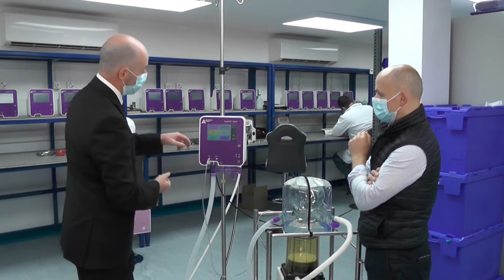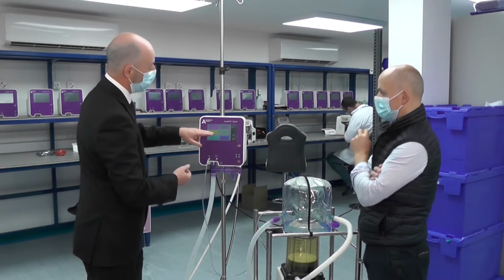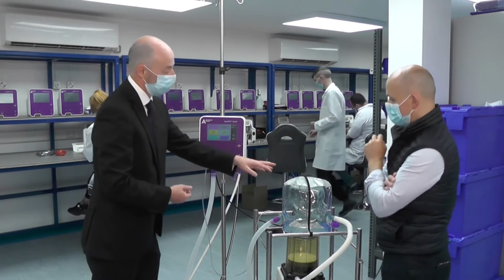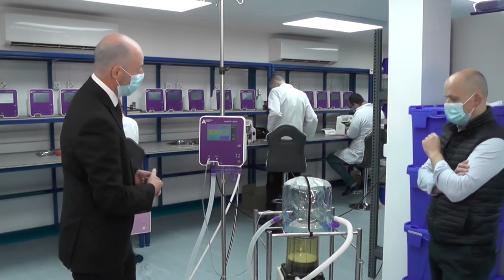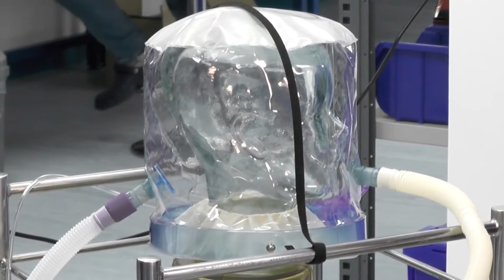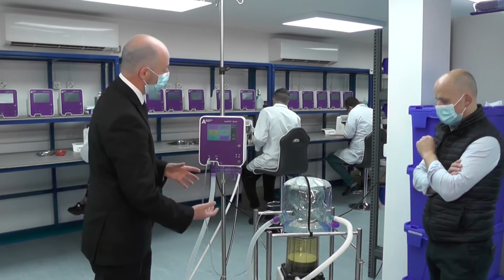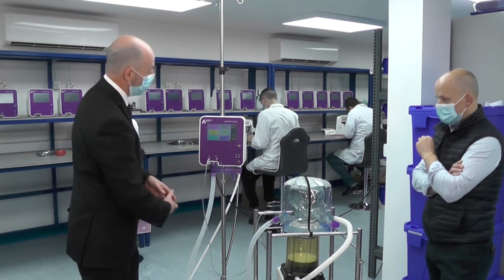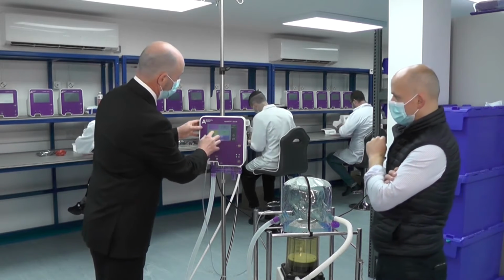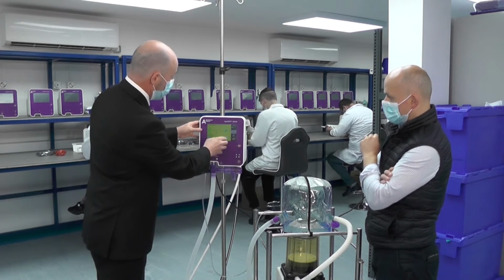We'll pick, for demonstration purposes, the CPAP mode, which is CPAP helmet mode, which is used with a CPAP helmet. And our simulation system here has a CPAP helmet. It has a mechanical ventilator for the purposes of generating the patient's spontaneous respiration. Select the mode, press OK.